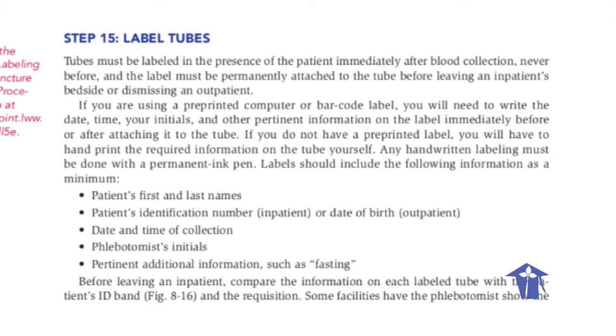Step 15, label tubes. Tubes must be labeled in the presence of the patient immediately after blood collection, never before.